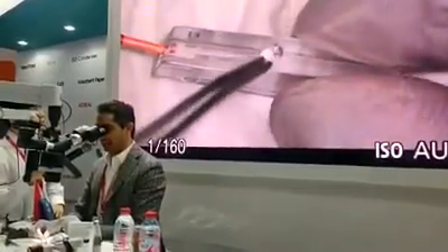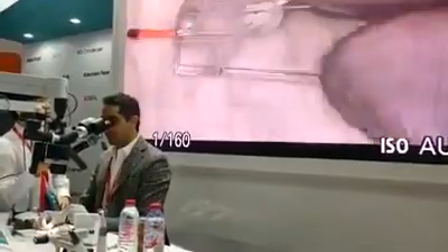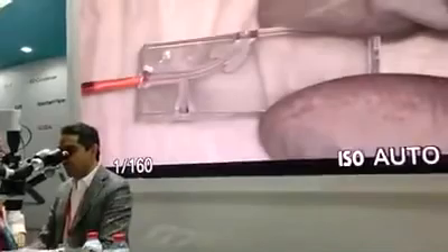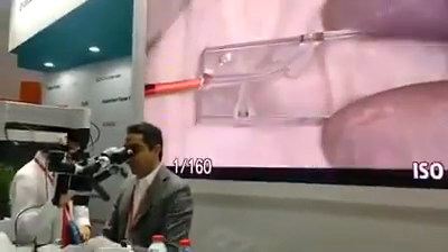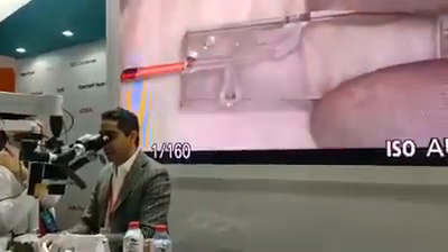Here are the apical ramifications and accessory canals already filled with TheraSeal, and it's coming out also from the apical foramen here. The flowability of the sealer will help you ensure that you are achieving 3D obturation for all complex root canal anatomy very easily and very efficiently.